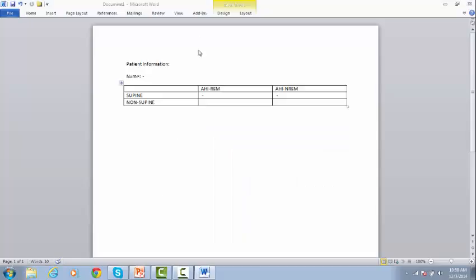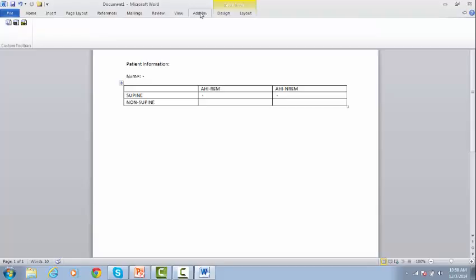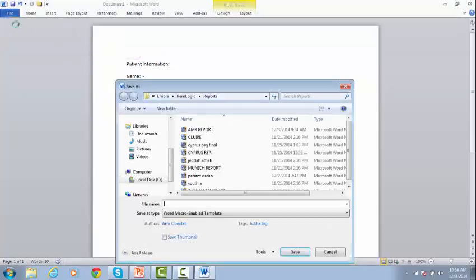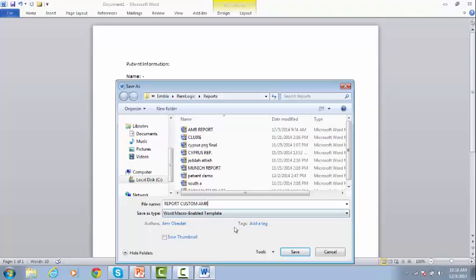If you want to save this report, go to Add-ins, click on the second option, which is to save as this report. Give it a name, and click Save.